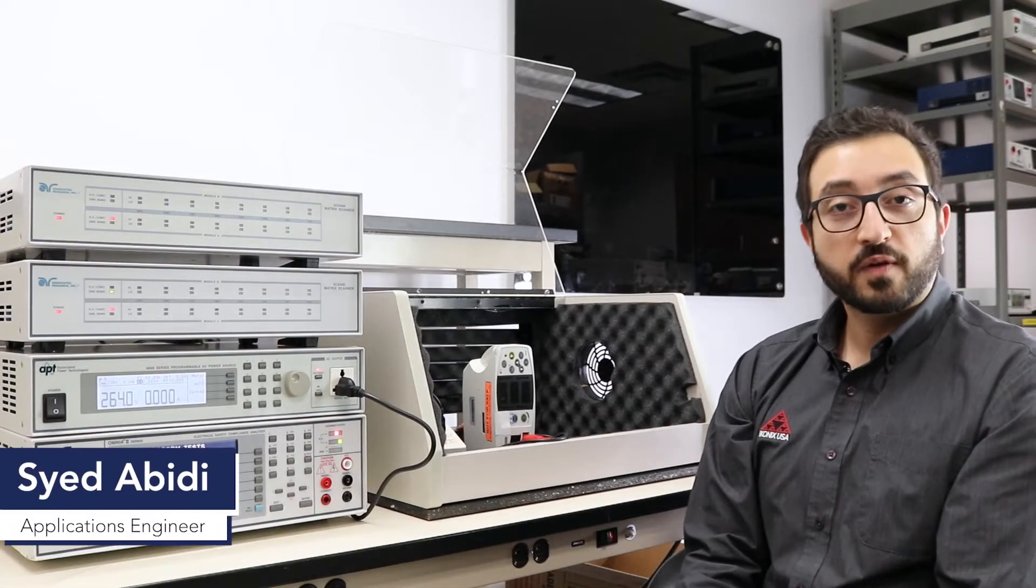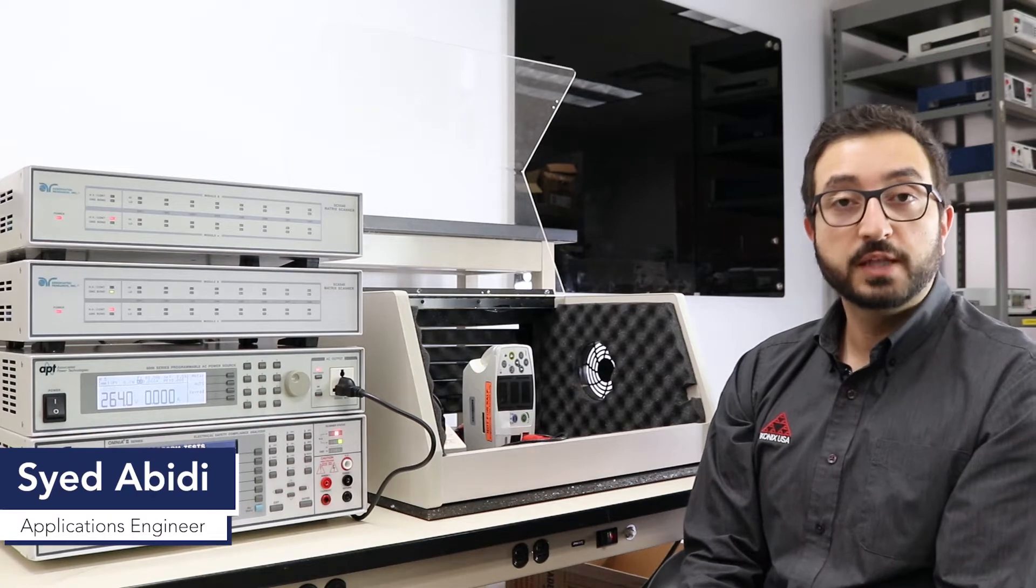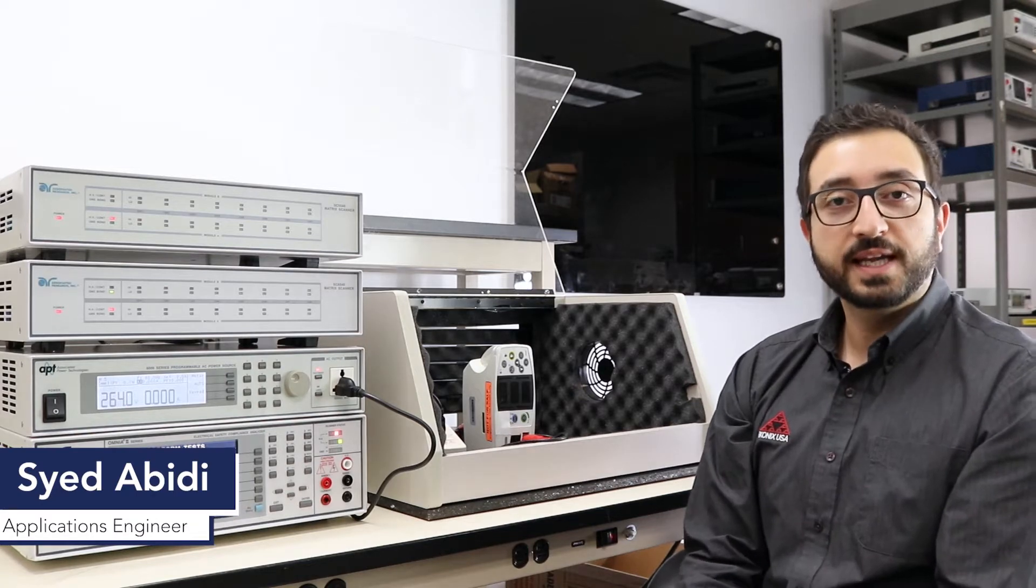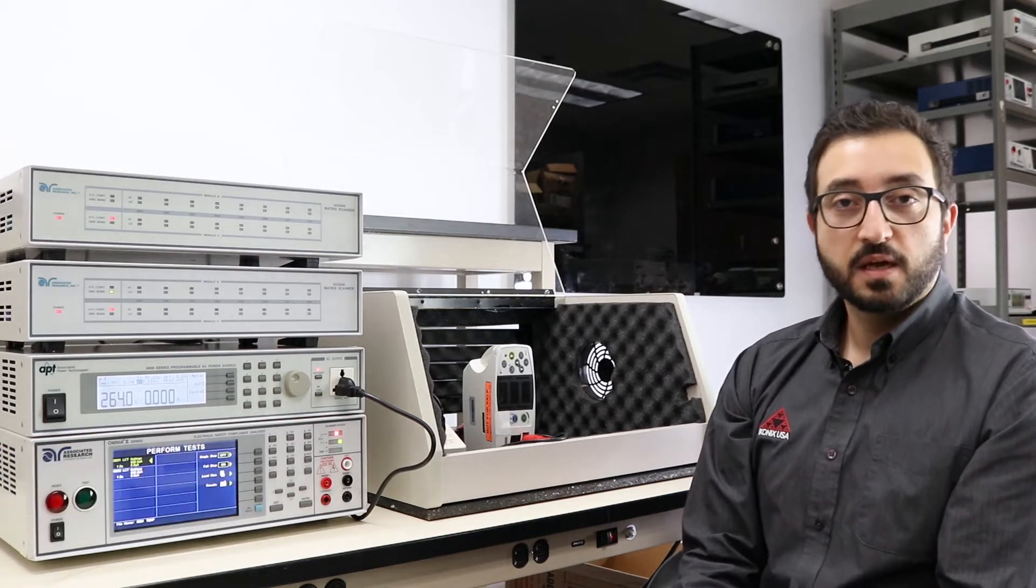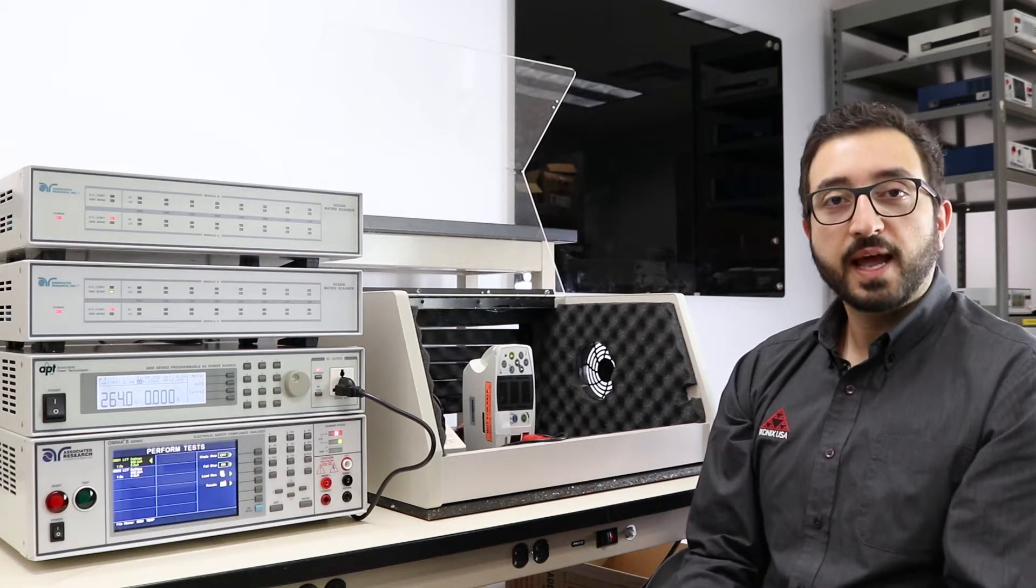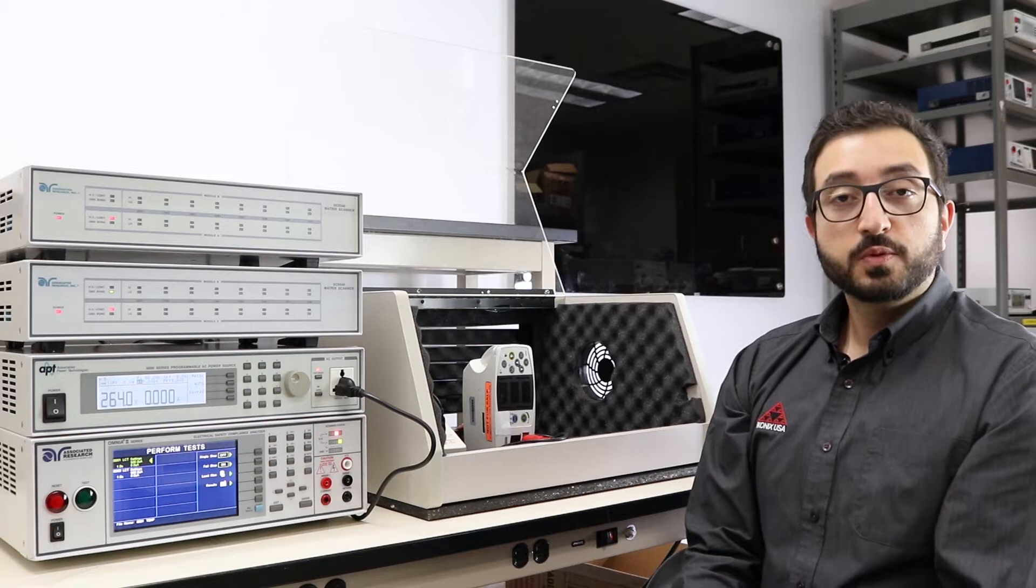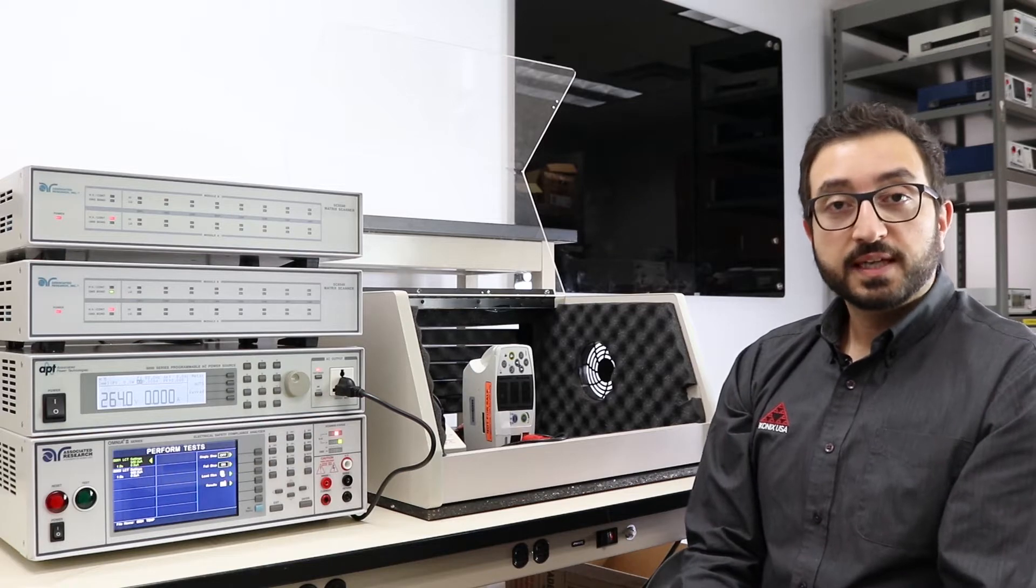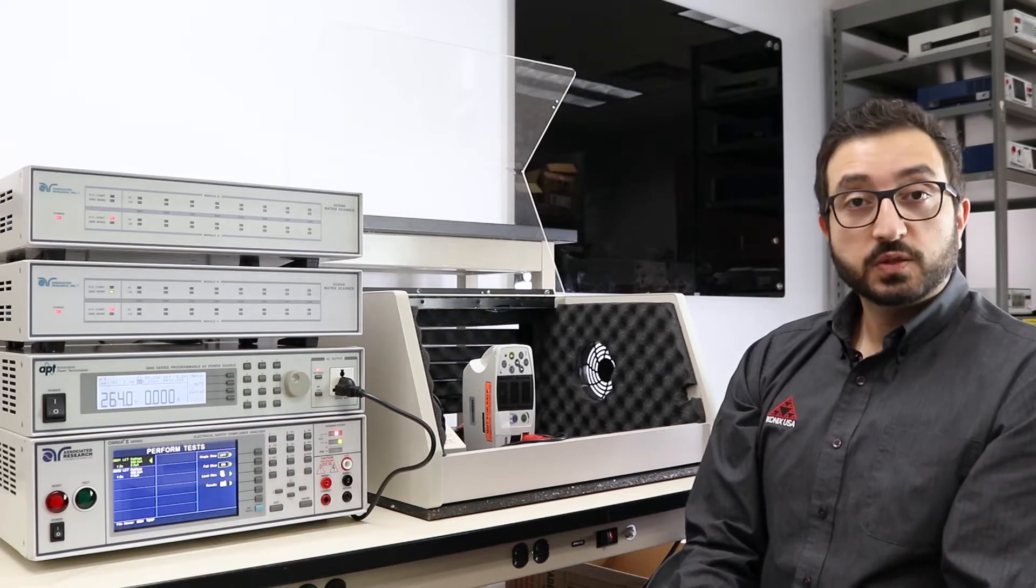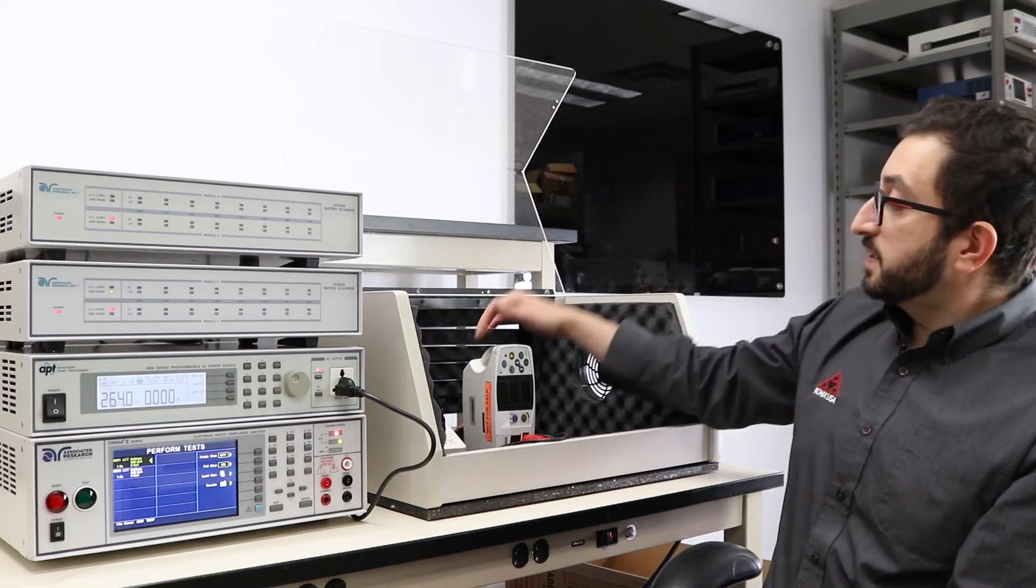Welcome to part two of our video on mains and applied part leakage current test. We are now in our lab and ready to perform two steps of the test on a class one medical device.